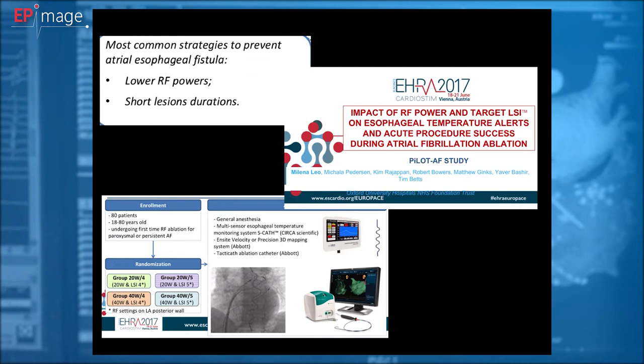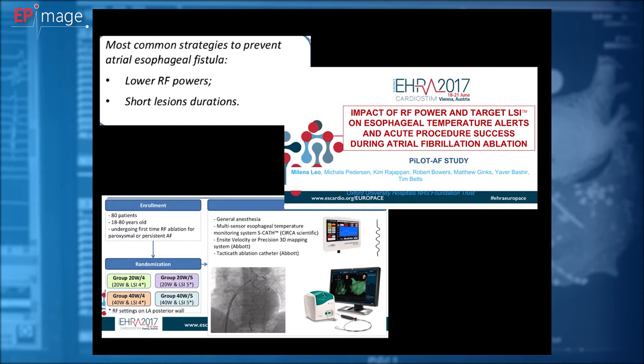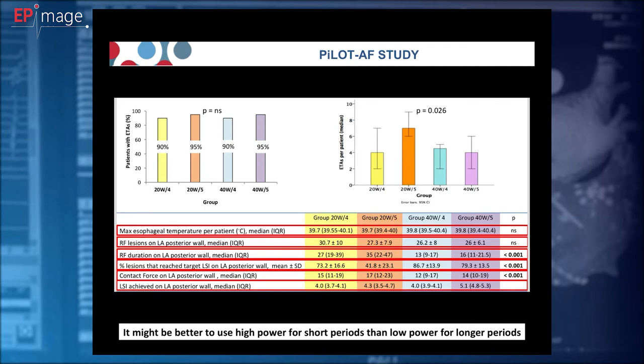Oxford group showed their pilot AF study where they compared two groups of patients treated with a standard approach, 20 watts on posterior wall and high power 40 watts ablation on posterior wall of left atrium. The applications were based on LSI. They wanted to reach LSI 4 or 5 depending on randomization group.